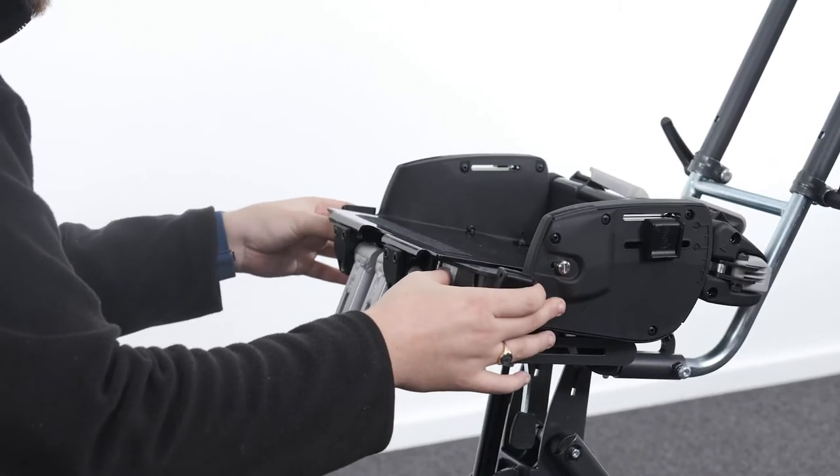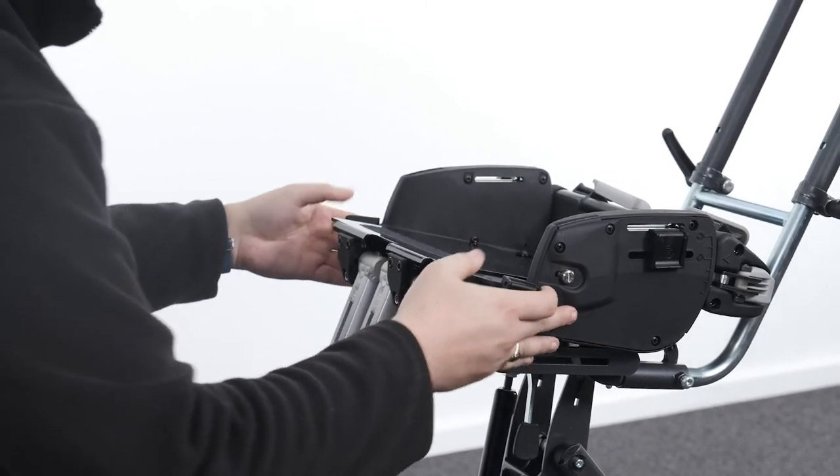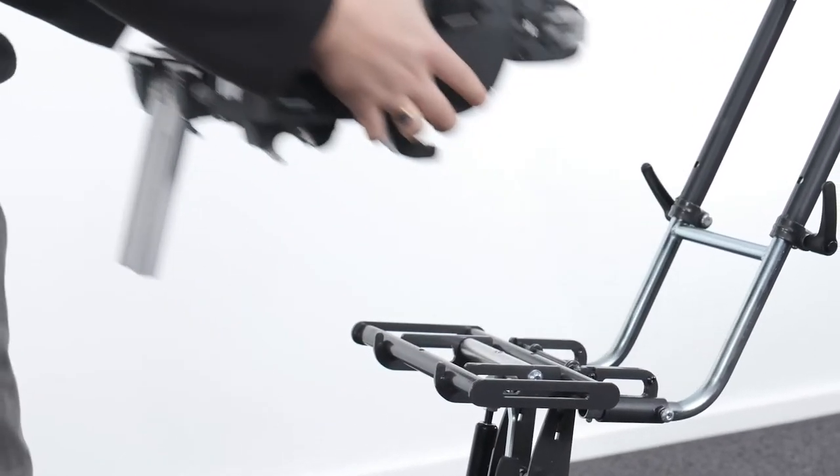To detach the seat, locate and release the locking latches as shown, then reverse the attachment steps.